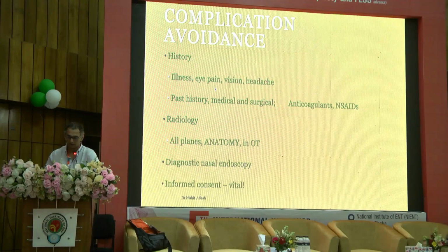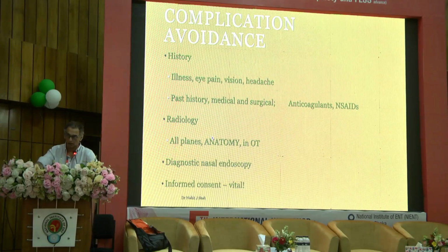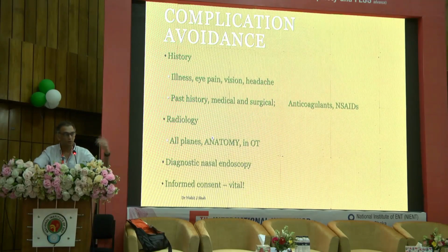When you are doing radiology, a limited CT scan, coronal scan is the worst thing you can do for your patient. You must have scans in all three planes, sagittal, axial, coronal. And unless you have this along with images on DICOM, it is not possible for you to get a 3D perspective of anatomy in the nose. And if you don't have the 3D perspective, understanding anatomy and working towards the sinuses becomes more difficult.